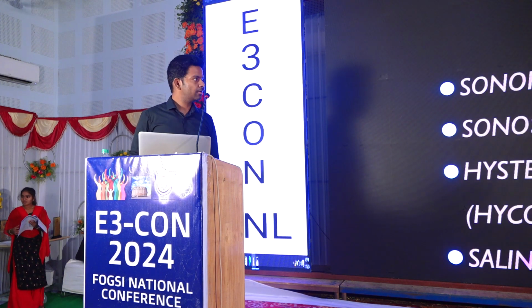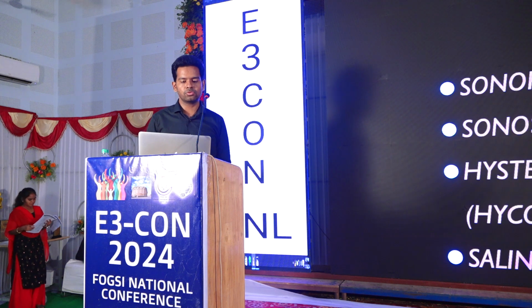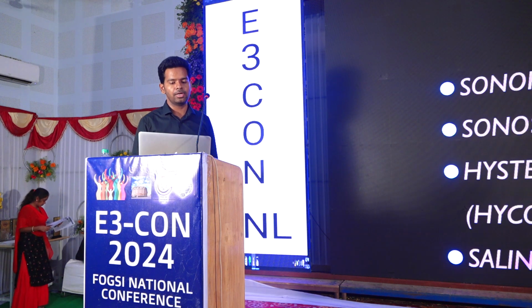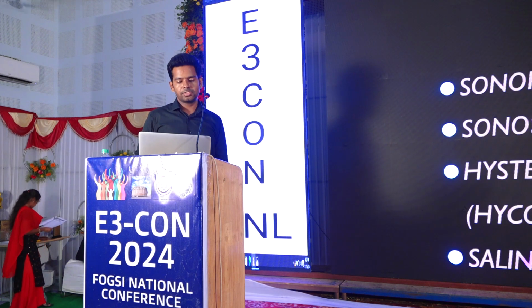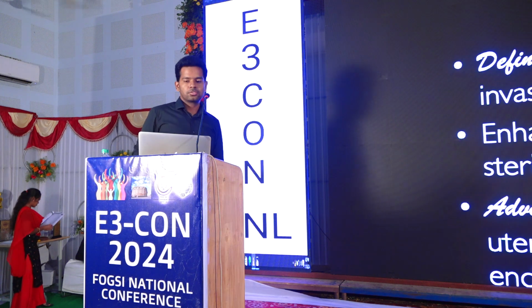So there are four modalities. One is sonohysterogram, sonosalpingogram, and when we use contrast, we will call it hysterosalpingo contrast sonography, and saline infusion contrast sonosalpingography.